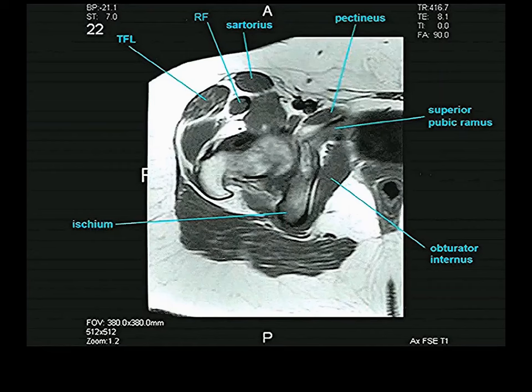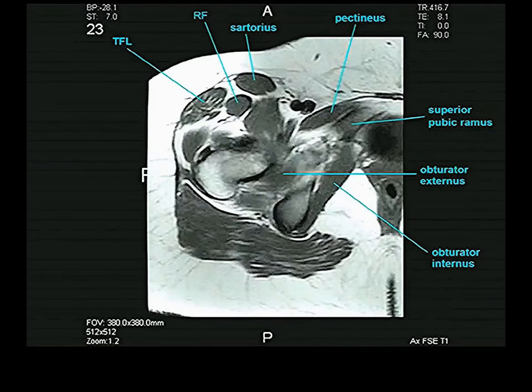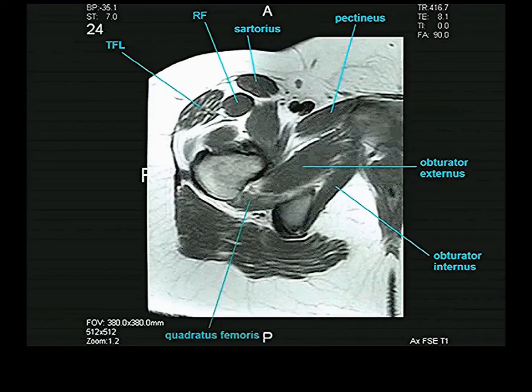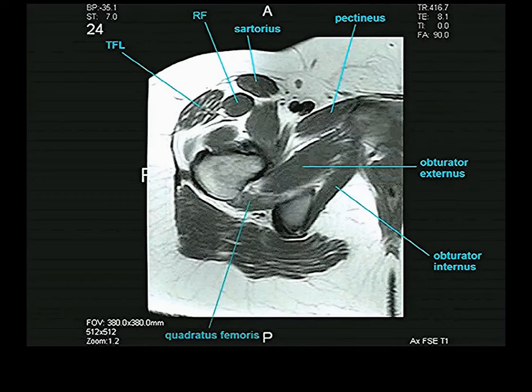The adductors are very hard to identify — you need to go back and forth to start identifying them. There is a muscle arising from the inner aspect of the ischiopubic ramus that sends its tendon around the back to the trochanteric fossa — that's the obturator internus. The obturator externus arises from the outer aspect of the ischiopubic ramus and sends its tendon to the trochanteric fossa. Both arise from opposite surfaces of the obturator membrane.